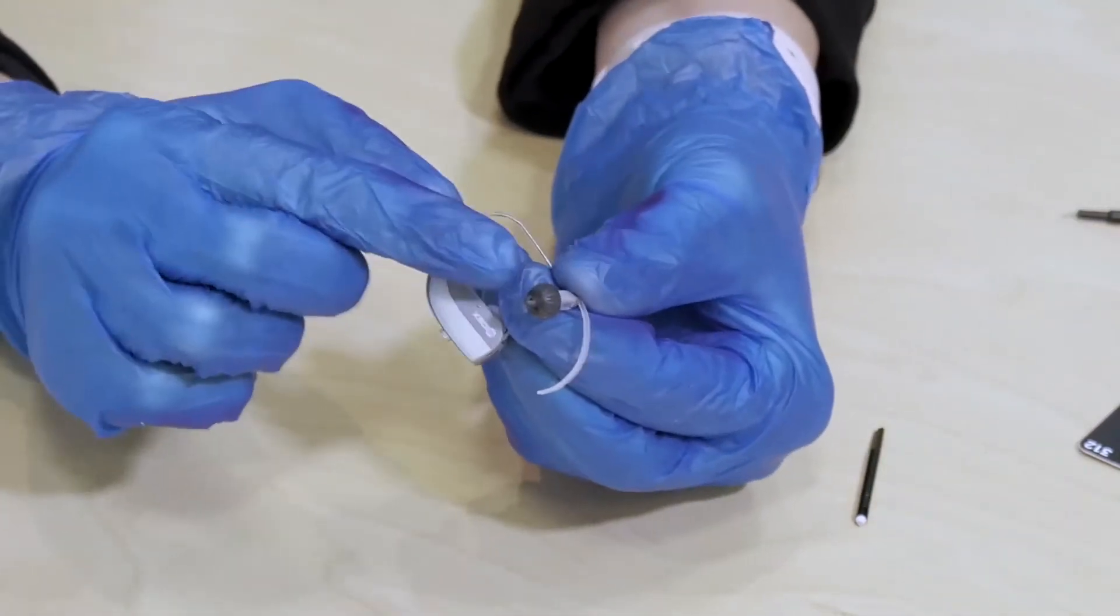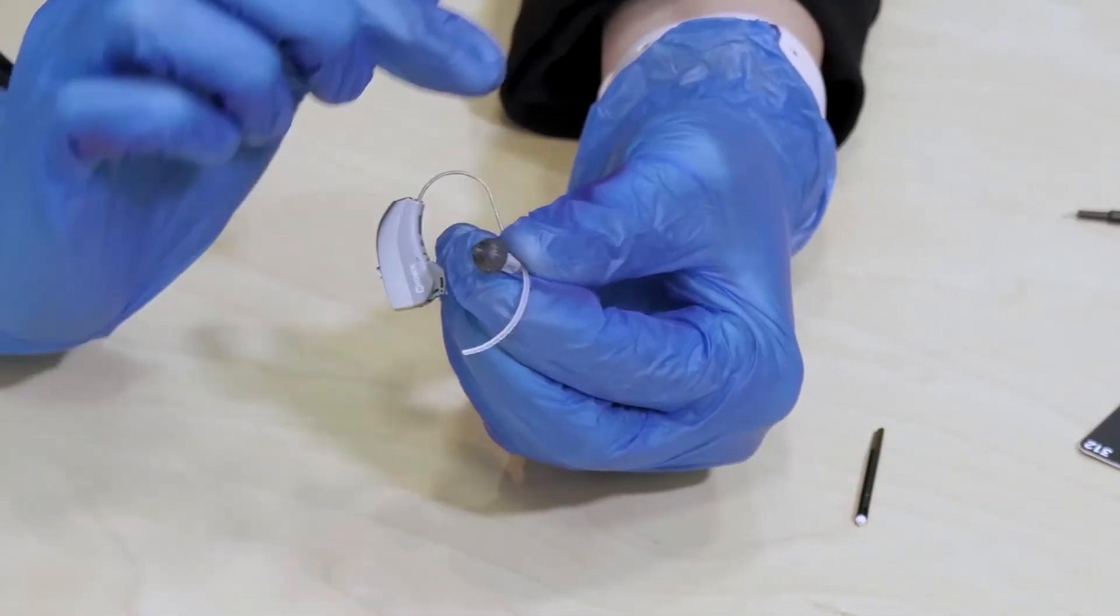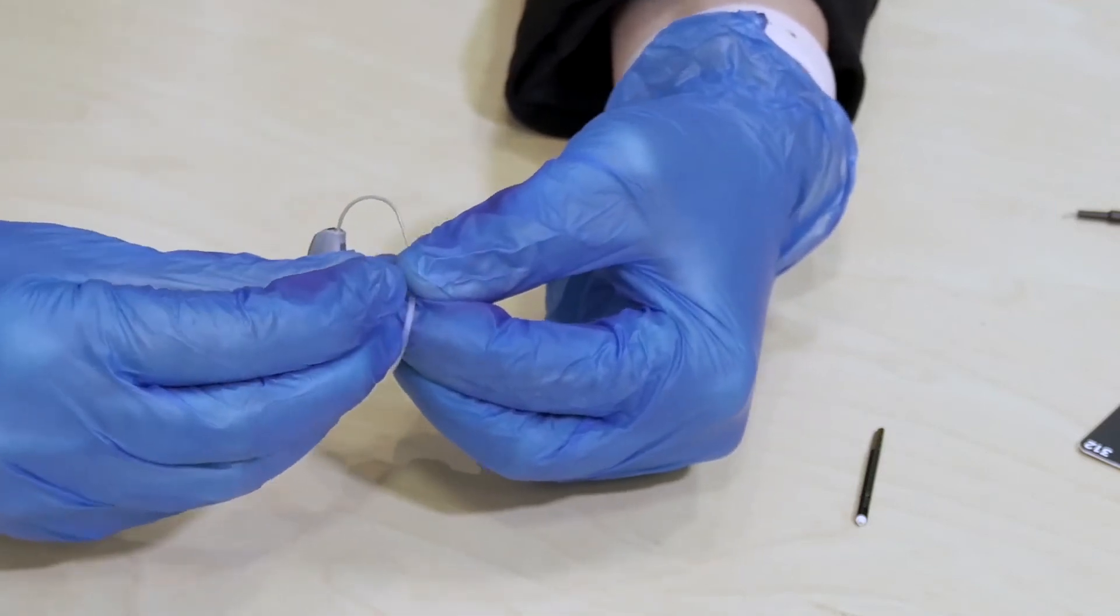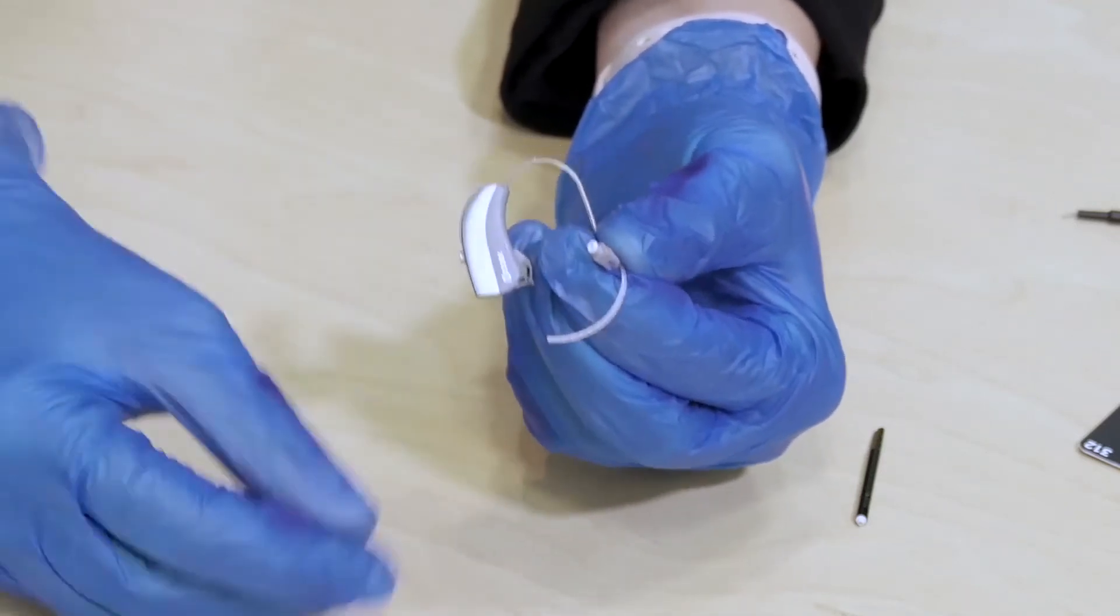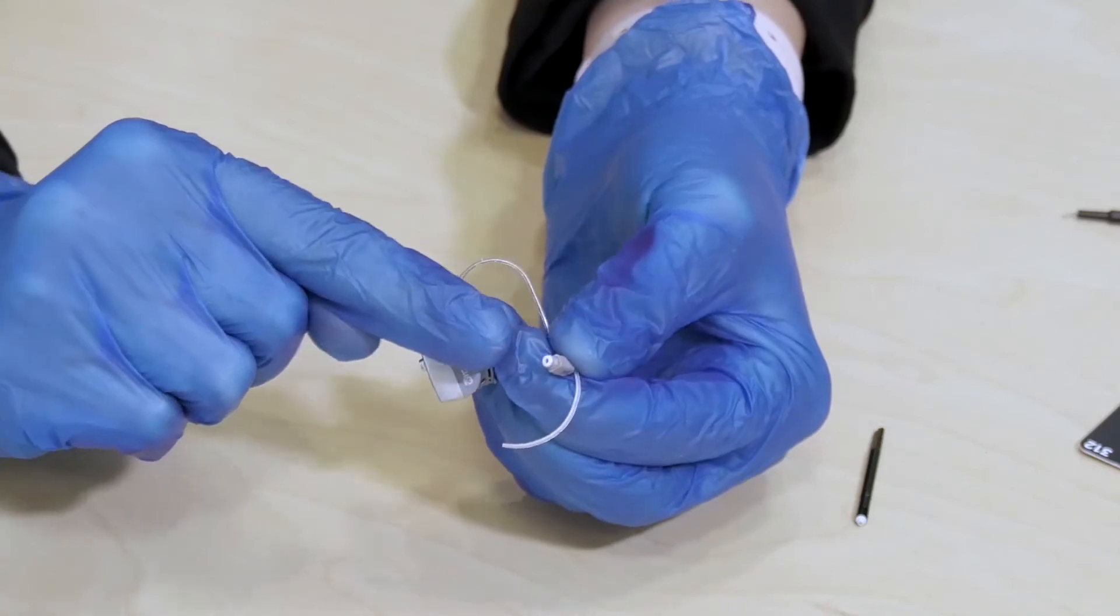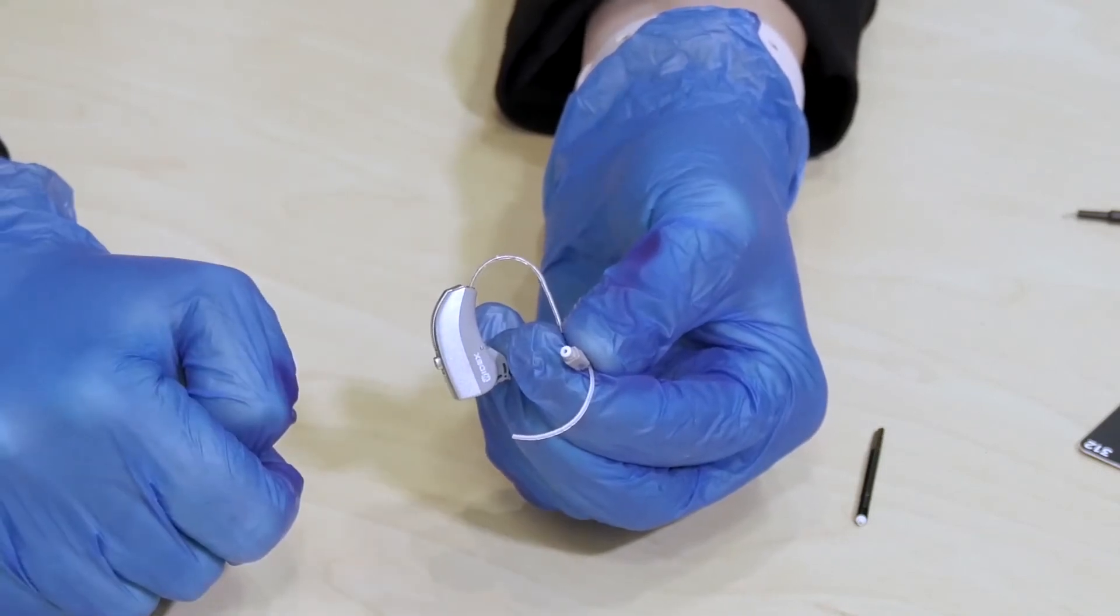Now on these ones you have this little dome that's on the end. To get to where the wax filter is you first need to pull off the dome that sits on the end to locate the old wax filter.